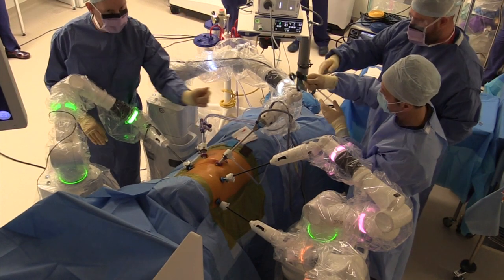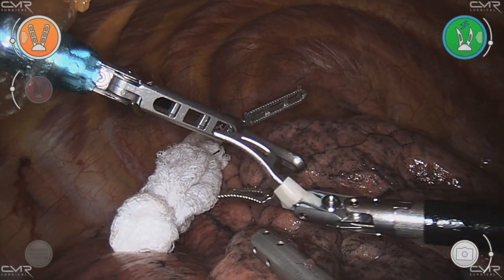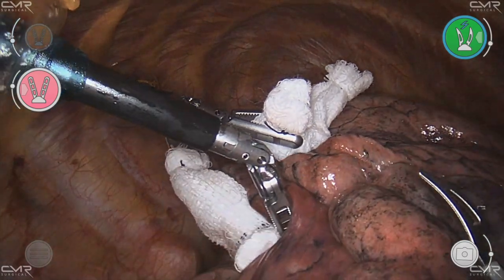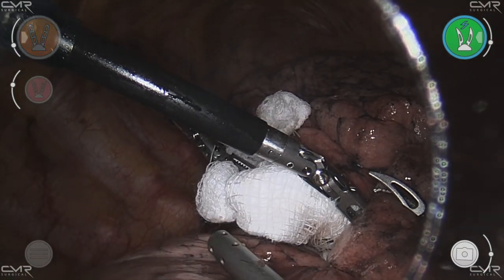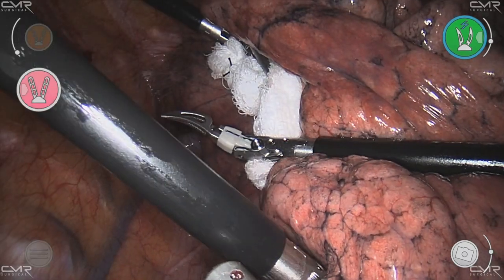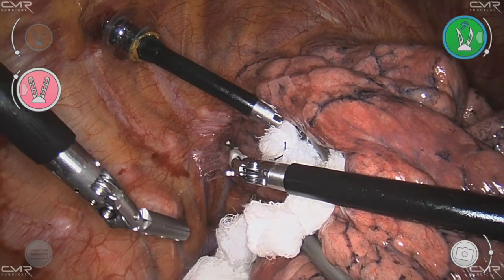There's plenty of space for the assistant — we've actually got an assistant at front and back for these early cases. Cutting across to the endoscopic view, you'll immediately notice the screen is different with Versus compared to other robots: the instruments are color coordinated. Because we've got two instruments on the left, we pulled the orange and pink to the left and the green to the right. The third arm is working very nicely. We've got two wide graspers that are really good for retracting the lung — we try to use swabs to press on the lung rather than grabbing. On the right we have a Maryland with bipolar energy. You can also have hooks, spatulas, and scissors with energy, but we chose Maryland and graspers for this case.